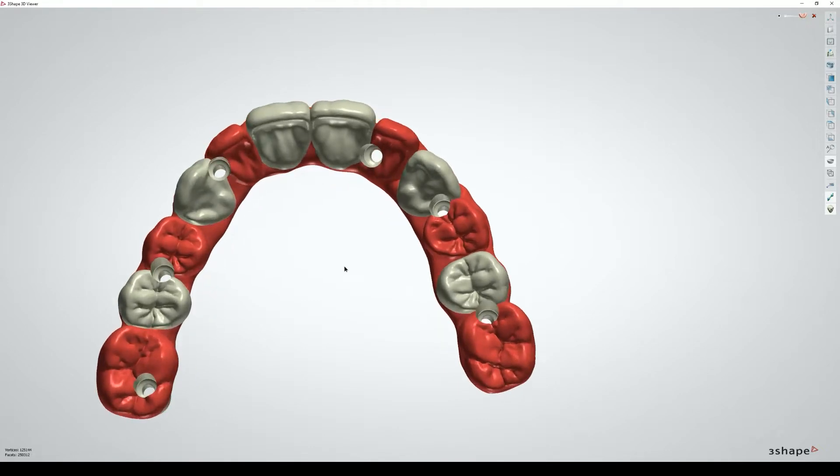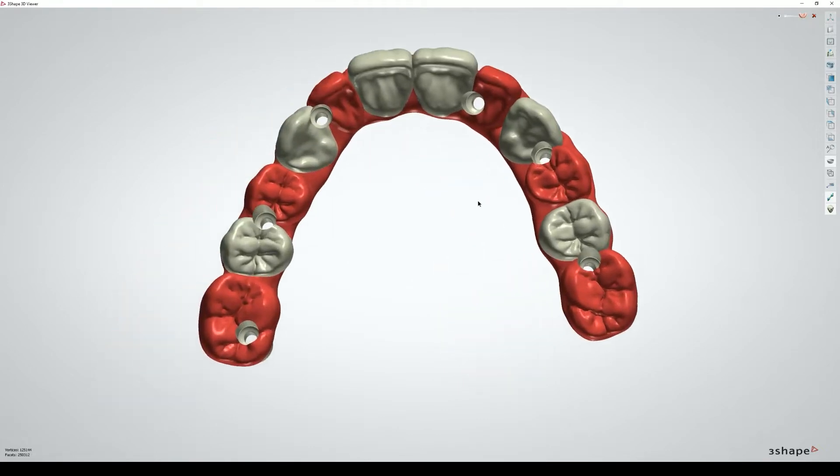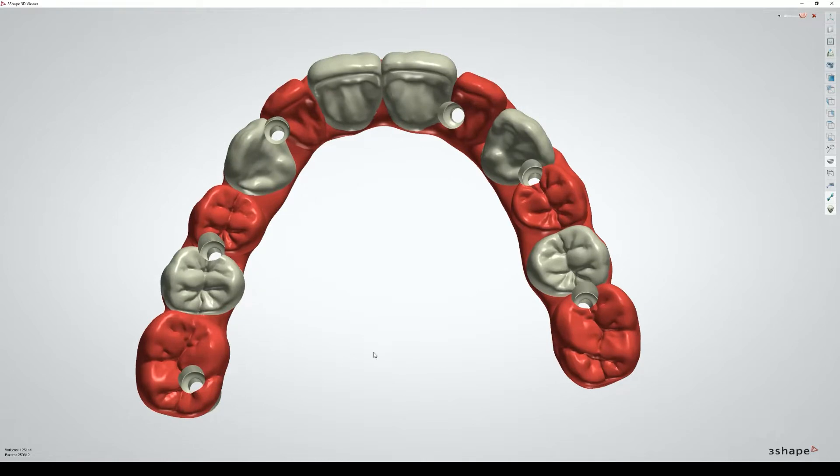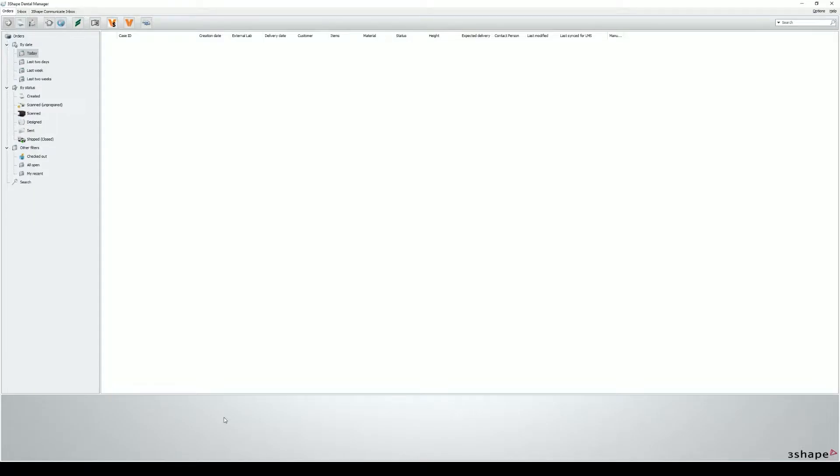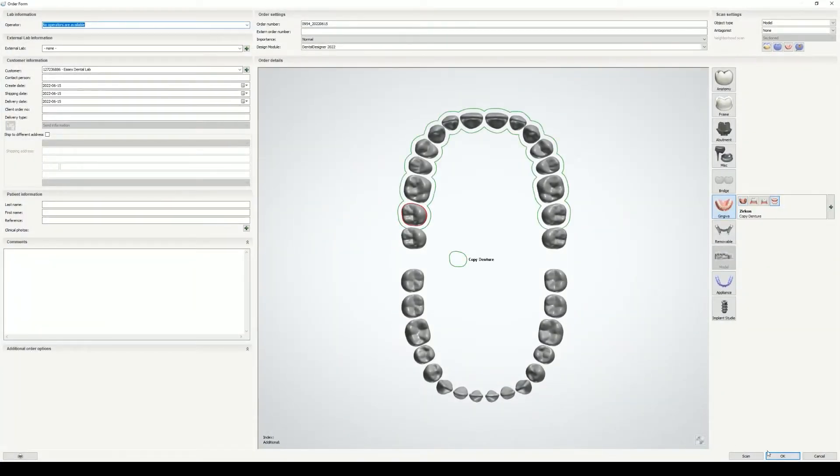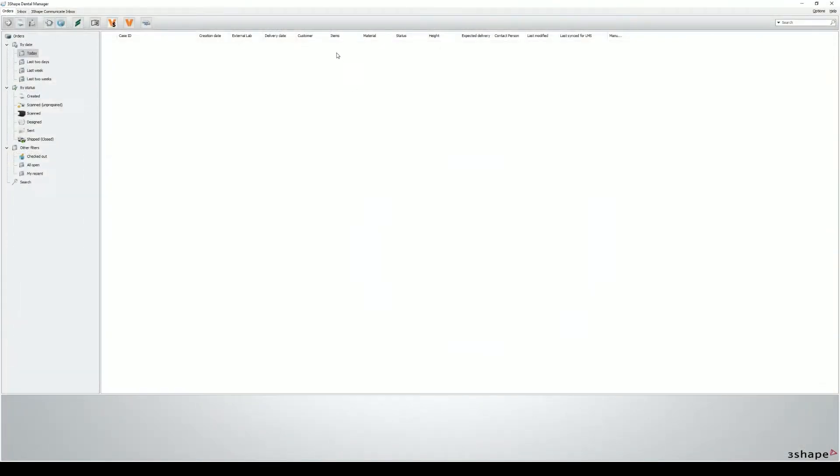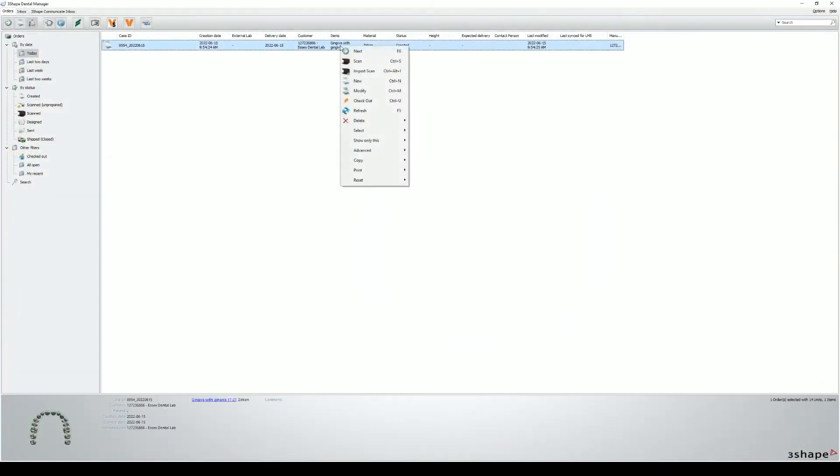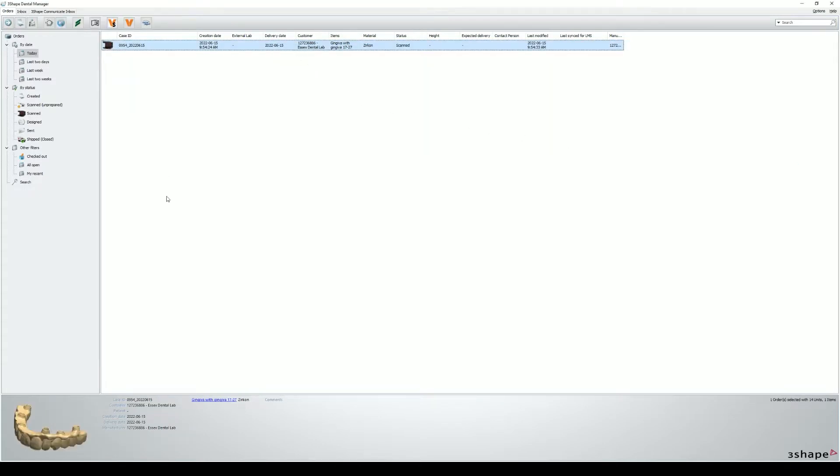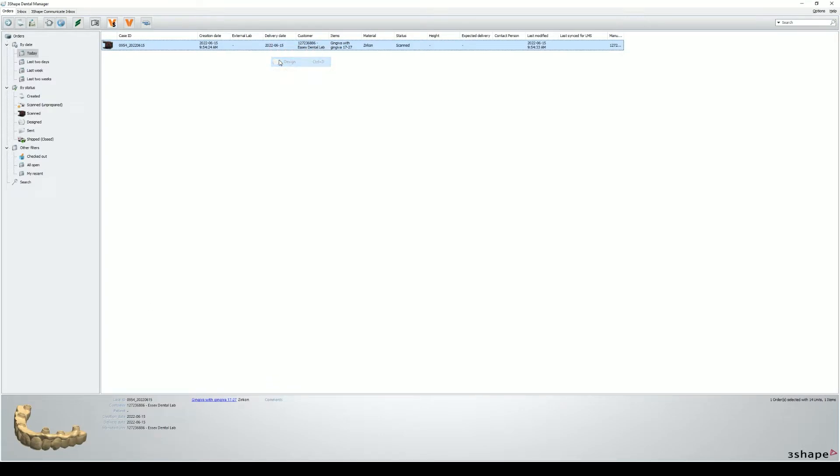The safer way that I've found is actually to bring this into copy dentures. This video is just to demonstrate how you do that. We'll go into Dental Manager, make a new order. I don't even bother naming it. I just made a dummy order where I saw copy denture. We'll locate that order, the CAD file for it, and import the scan. We import the CAD DCM of it and do the design.